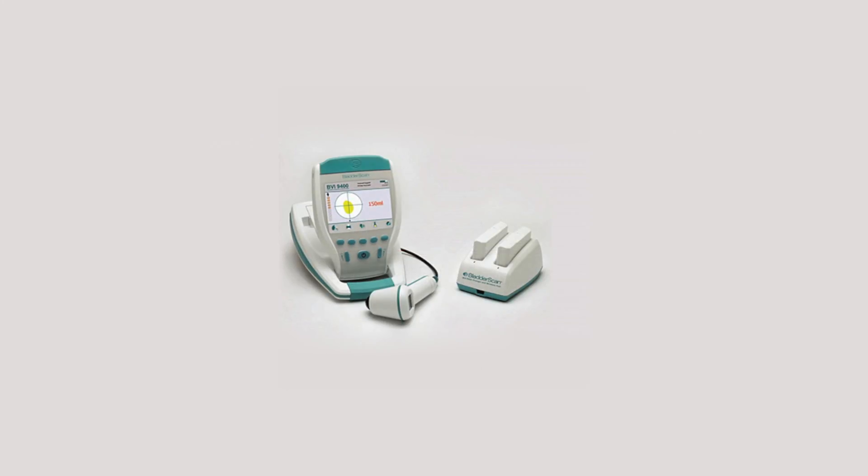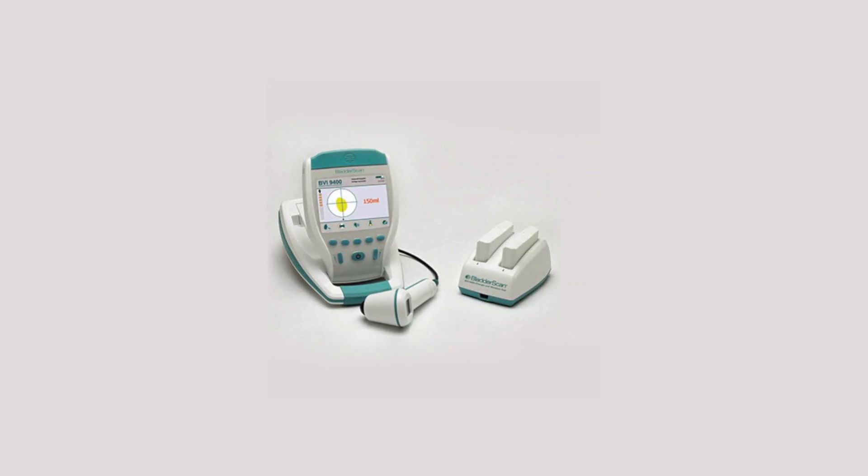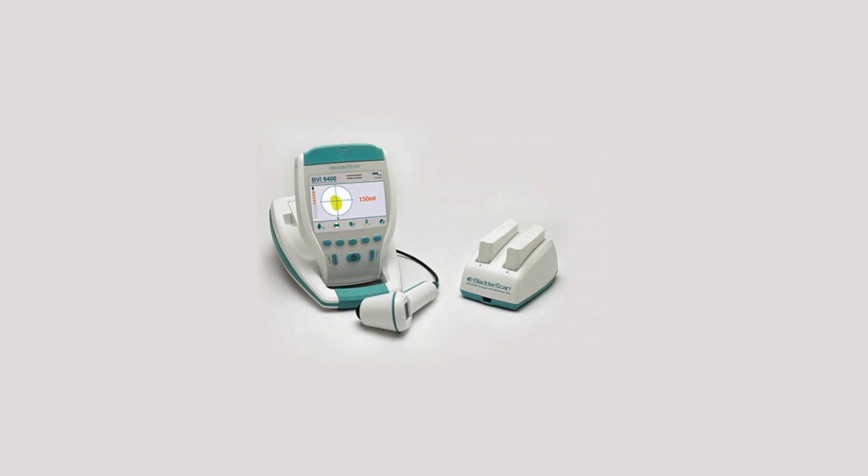The Bladder Scan BVI9400 is quick and easy to use. When the user releases the scan button, within seconds the BVI9400 calculates and displays the bladder volume.